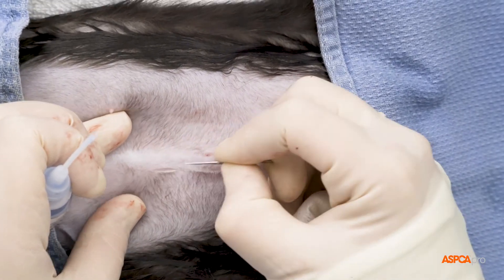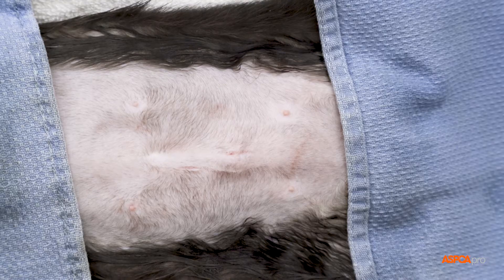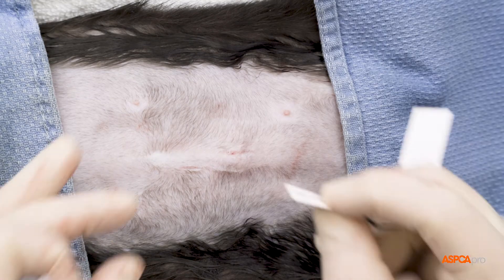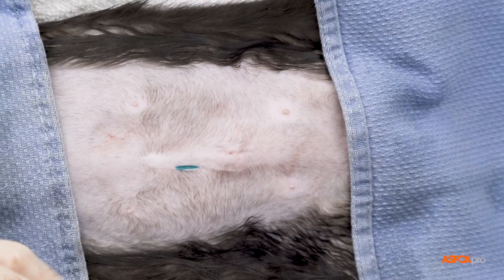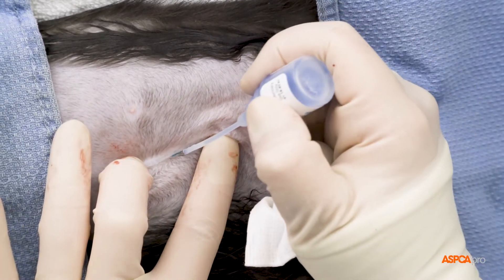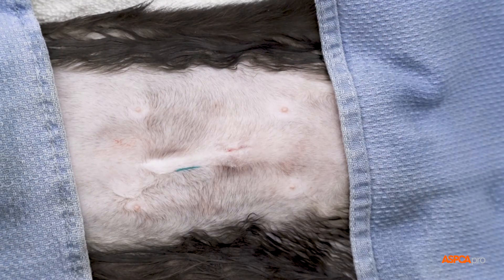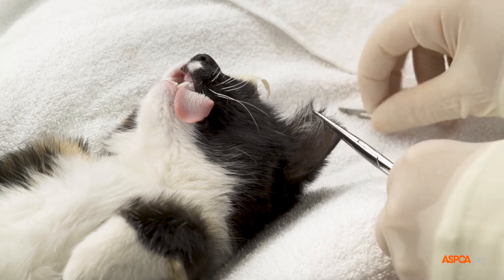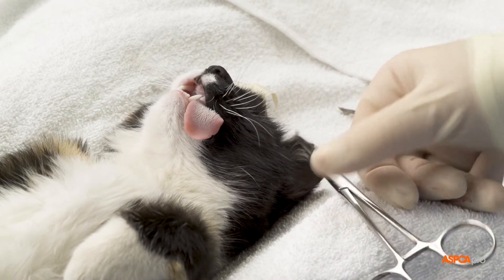Finally, as with all of our surgeries, we place a small green tattoo next to the incision to indicate that the cat has been sterilized. We then seal the tattoo with surgical glue. Community cats also receive an ear tip in order to identify them from a distance as being sterilized.